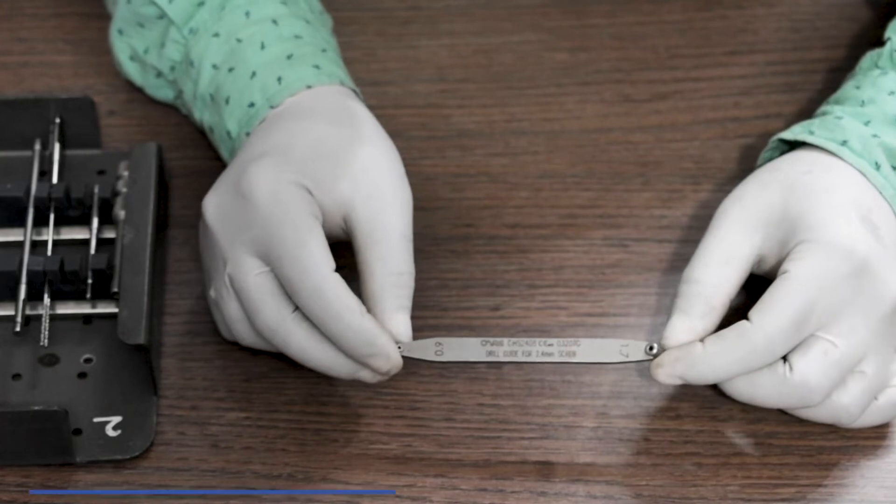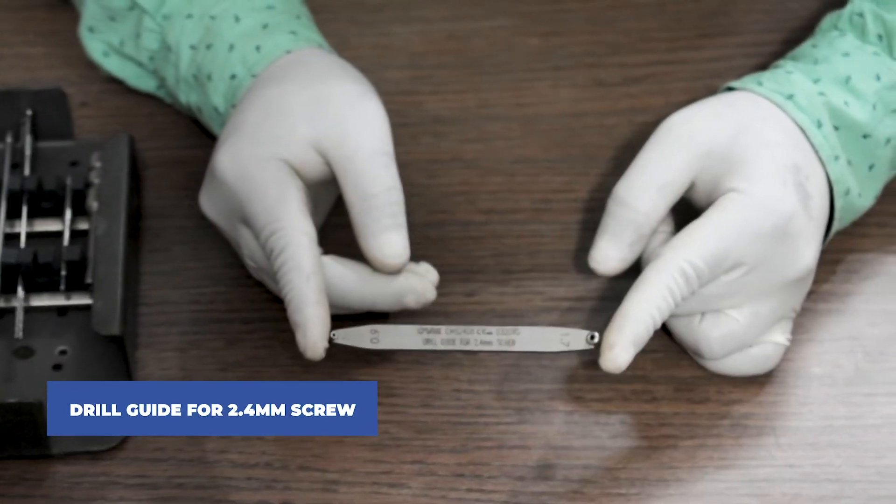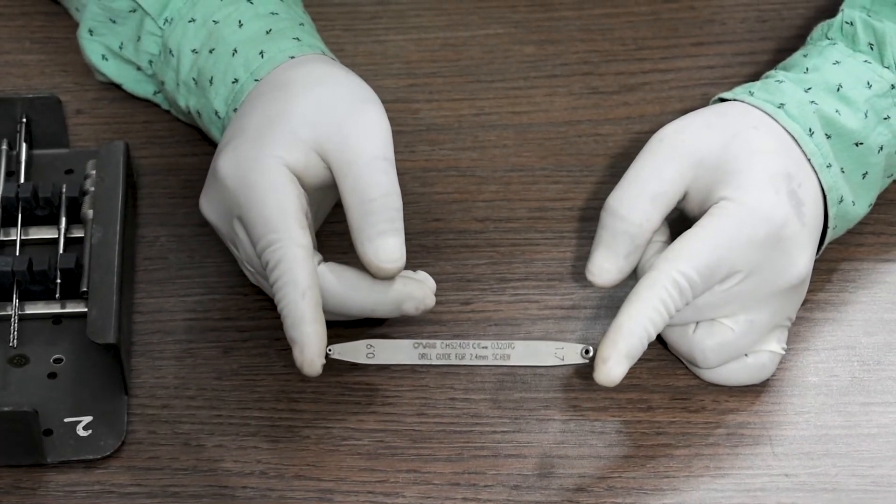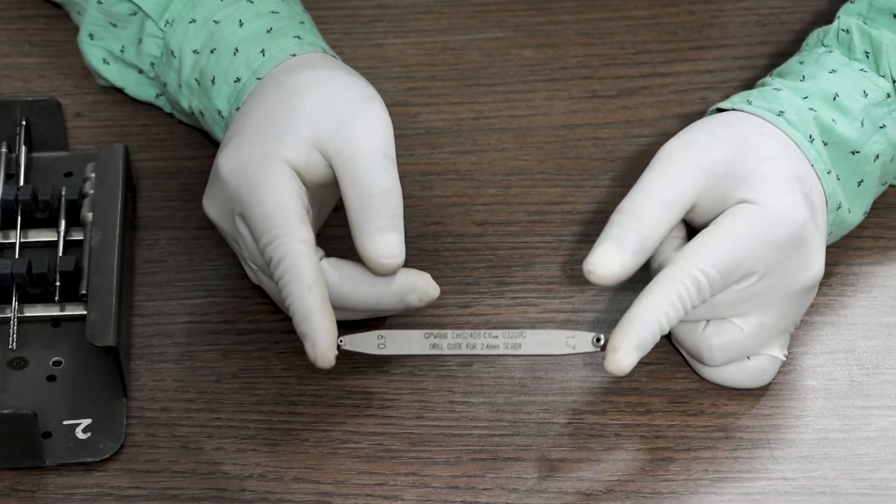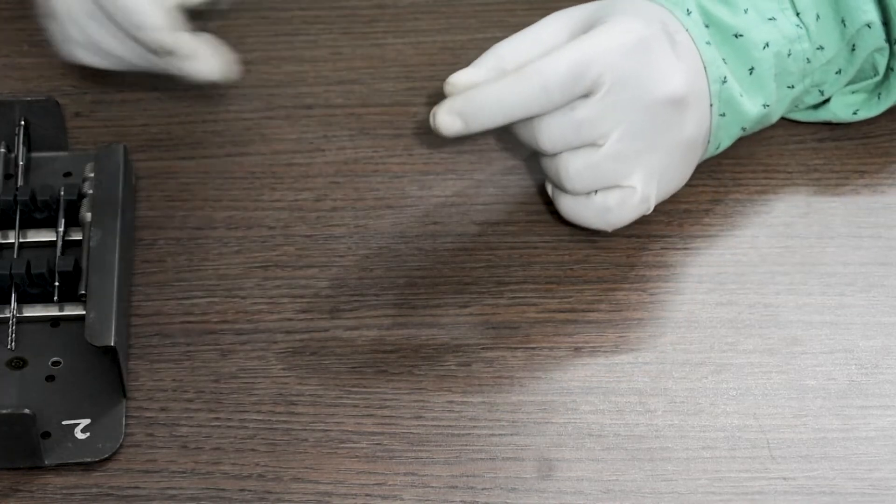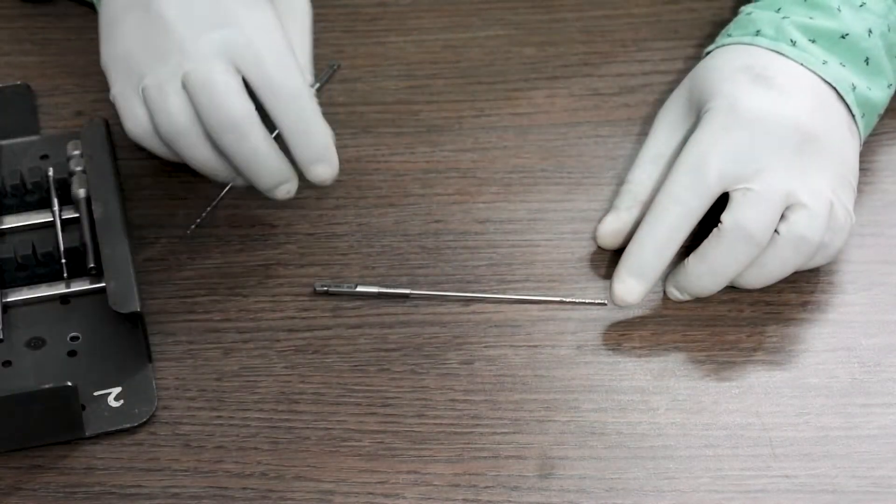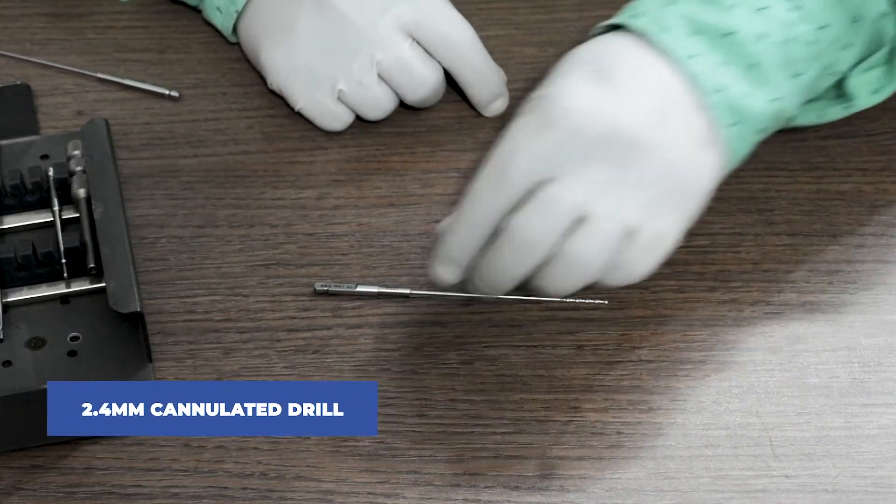This is the drill guide for 2.4mm Herbert Screw. This one is a 2.4mm cannulated proximal drill bit.